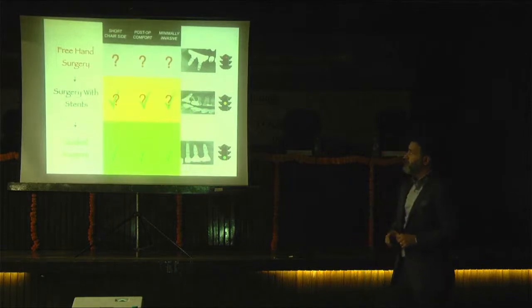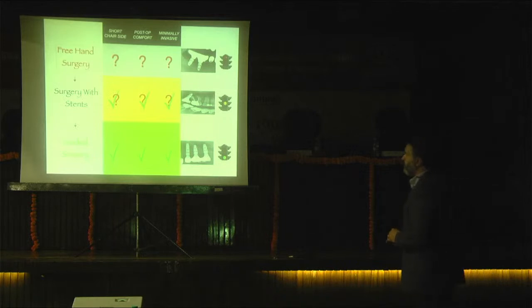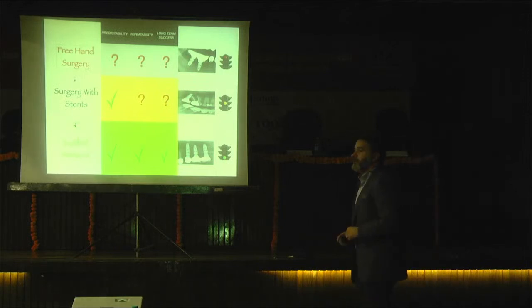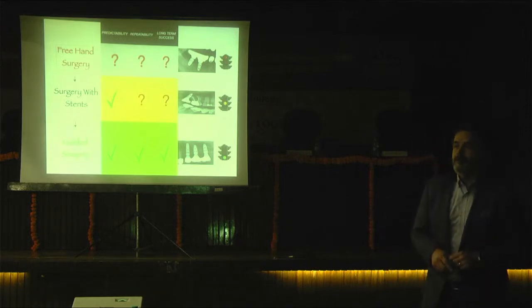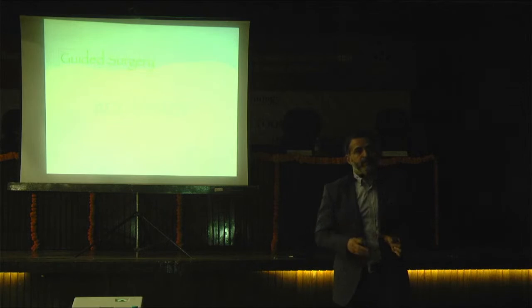Again, freehand surgery, surgery with stents, and guided surgery, regarding short chair side time, post-op comfort and minimally invasive procedures protocol. And again, we can see that guided surgery is superior in all three parameters to the other procedures and protocols. And the last one, which is very important: predictability, repeatability, and long-term success. Guided surgery is superior to the other protocols. So, guided surgery means accuracy.